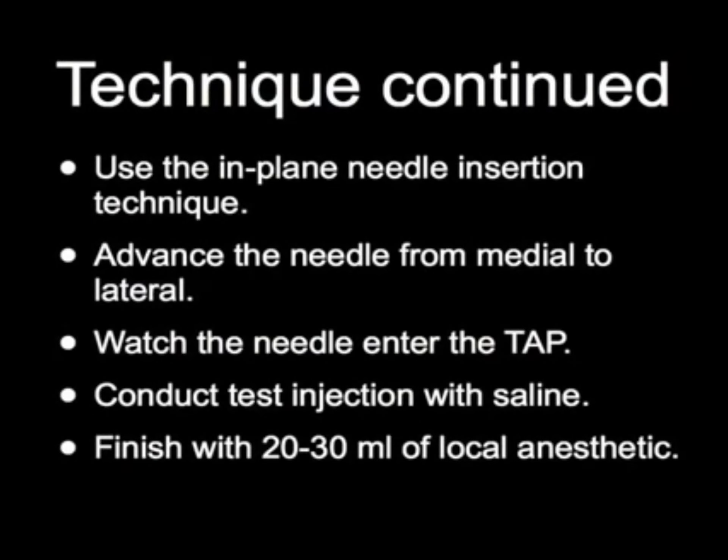Use the in-plane needle insertion technique. Advance the needle from medial to lateral. Watch the needle as it enters the TAP. Conduct a test injection with saline. Finish with 20 to 30 ml of local anesthetic once the saline injection confirms correct needle location.